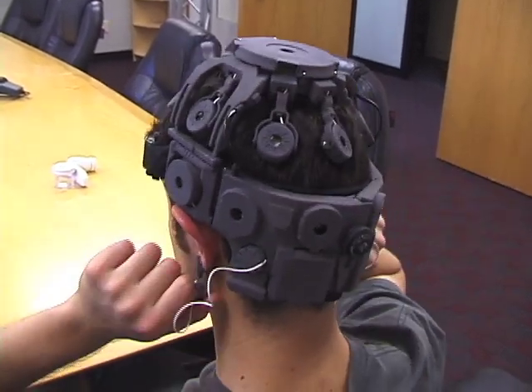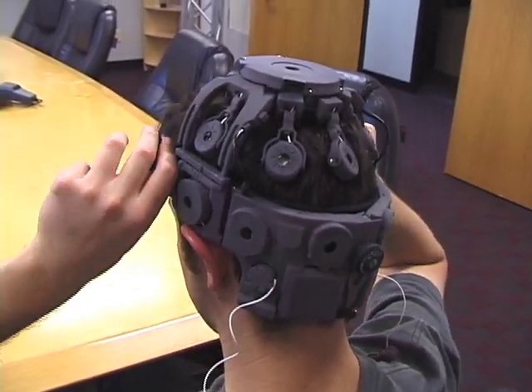Removing the headset is easy. Simply pull out the adjustment knob, remove the ear clips, then lift the forehead strap over the brow and slide the headset off.